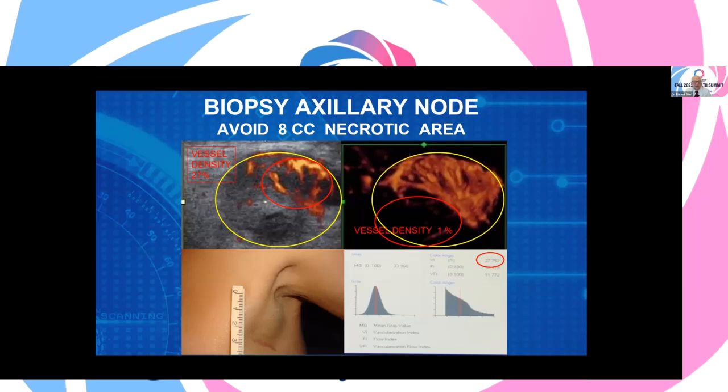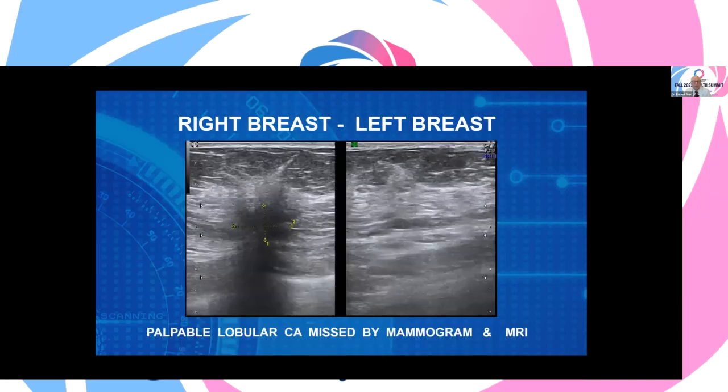Let's look at the next slide, which will show the obvious nature of cancer with high-resolution ultrasound. On the very top, you see some stripes on the area. This is the skin. That's the first thing we look at when we scan. We want to see how good is your ultrasound image.